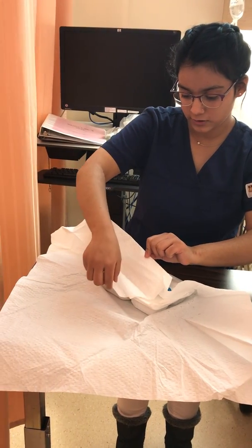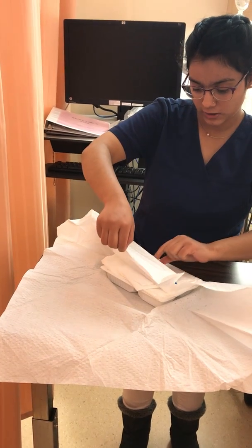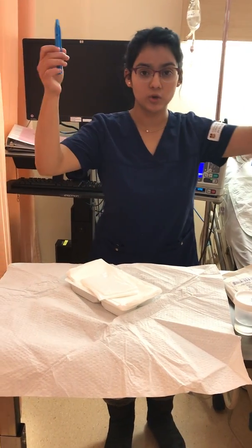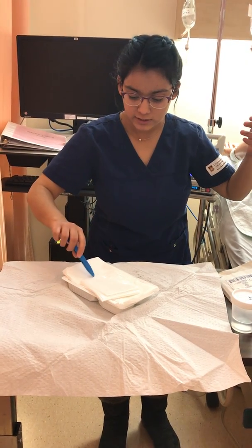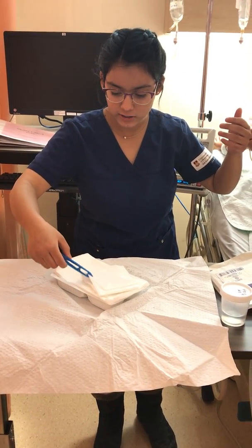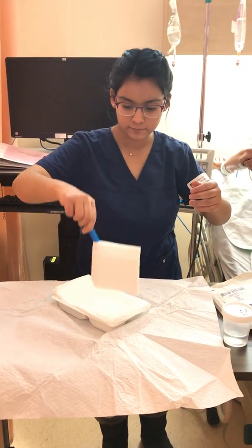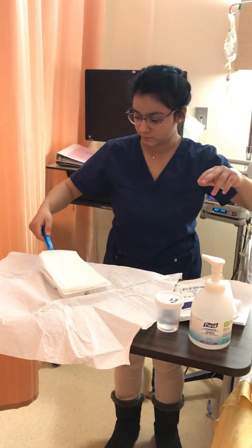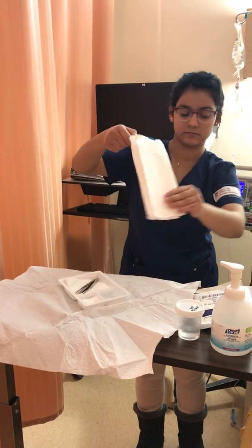And since that's very close right there, since I haven't touched any of it, I'm going to make sure that my hands are always above the things. And I'm just going to get rid of my garbage because I don't need it, which is what I kept 2 by 2. So now I'm going to put this by the side over here. 10 minutes remaining. And I'm going to put my number 7.